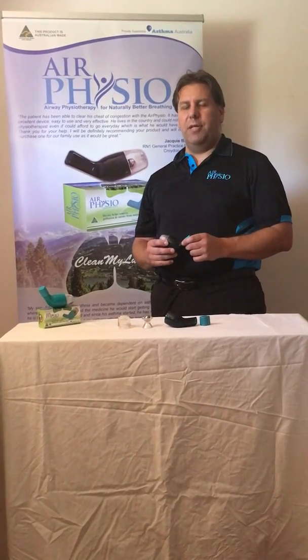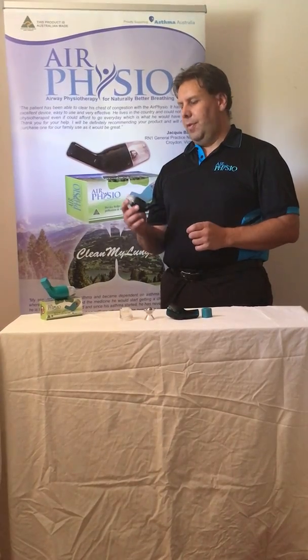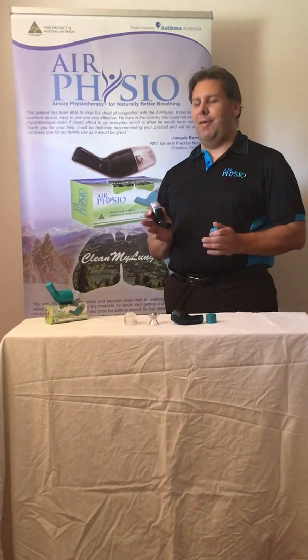Many people ask what Air Physio is and how to use the device. It's very simple. Air Physio stands for Airway Physiotherapy and it's an oscillating positive expiratory pressure device. Now most people, not in the medical industry, turn around and go, well what is that?